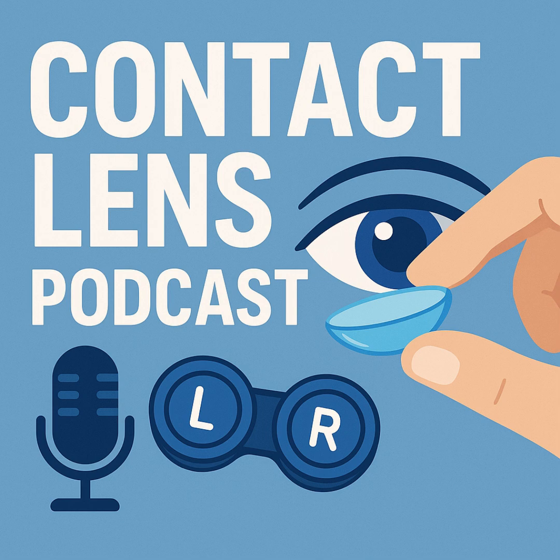Okay, so wrapping this up then. Choosing a contact lens is clearly way more than just matching a prescription number. Oh, absolutely. We've hit on spherical, toric, multifocal for vision needs. We've talked schedules, daily, 2-week, monthly, mentioned RGPs and sclerals. But finding your perfect lens, it's so personal. It's about the material, how it feels on your specific eye, how it interacts with your tear film, the fit, your lifestyle, whether you have dry eye.